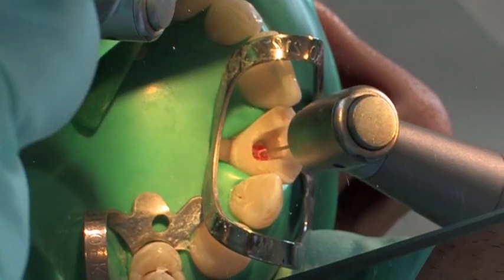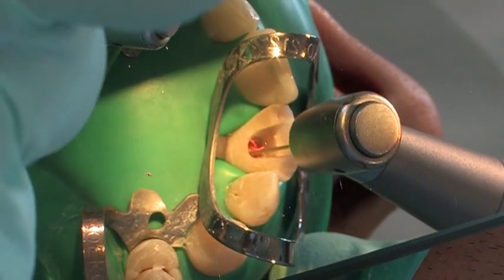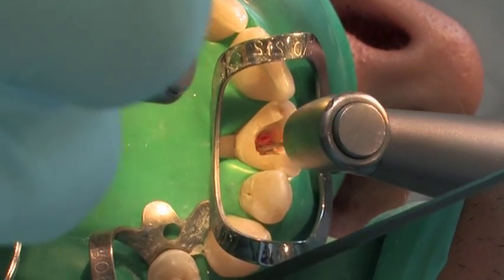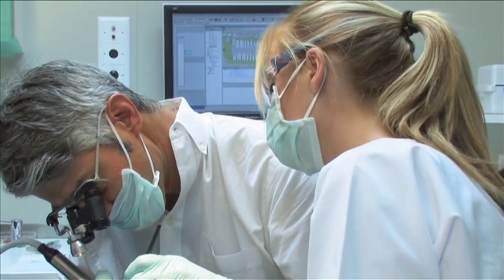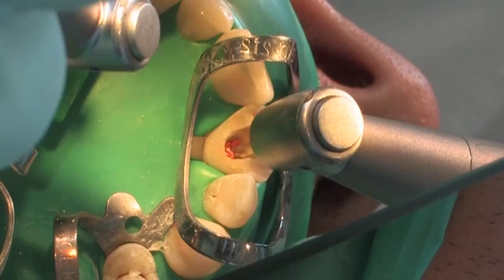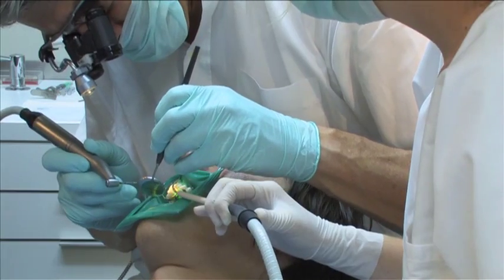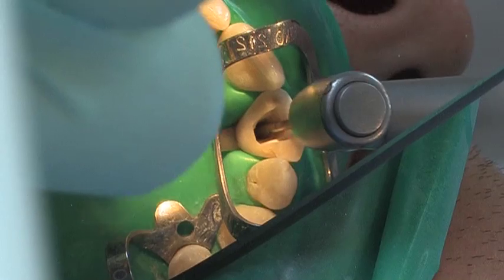The root canal filling material is removed to the predetermined depth using suitable root canal instrumentation. At least 4 to 5 mm of root canal filling should remain intact for an apical seal. The post space is then prepared using the color-coded ParaPost drills in sequentially larger sizes until the predetermined post diameter and depth is achieved.